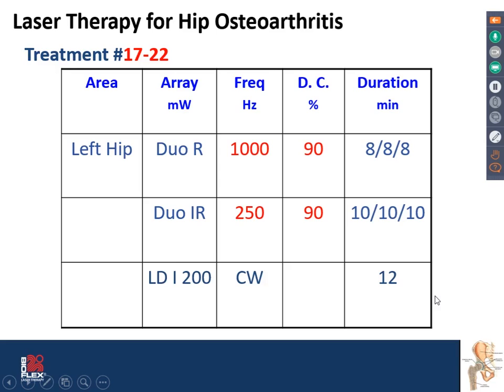Just bear in mind the treatment times are extensive. The time that you hold the probe is much longer than standard, and these patients aren't going to have remarkable recoveries in just a handful of sessions. And so everyone needs to be on board with that as well.